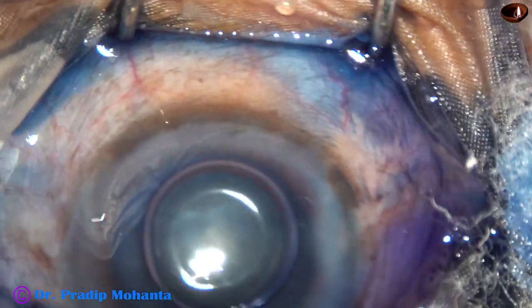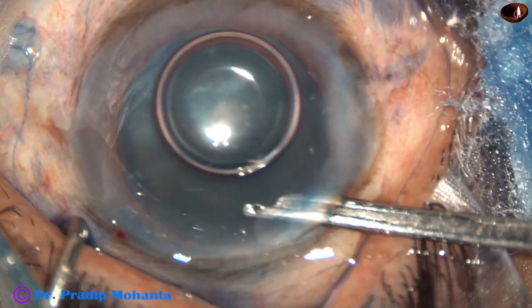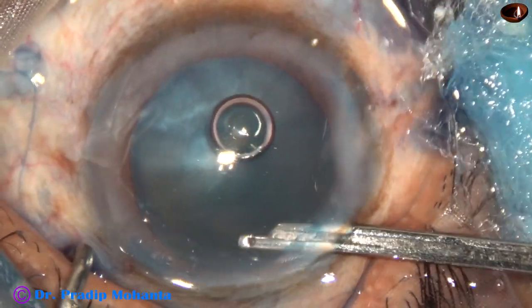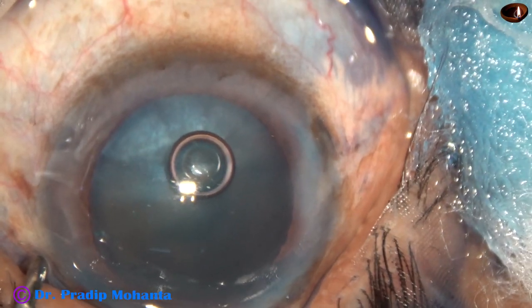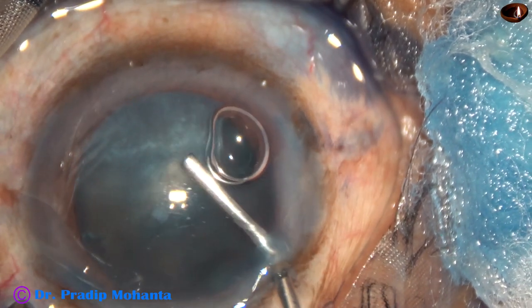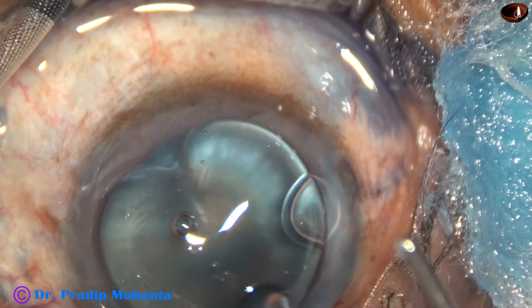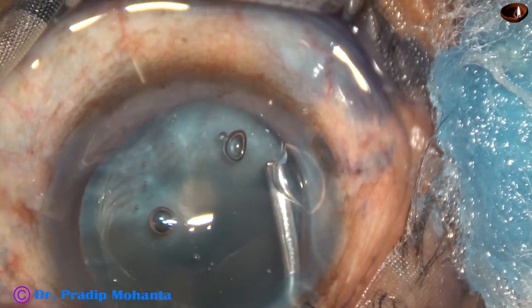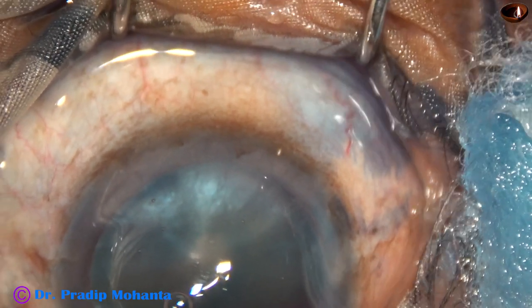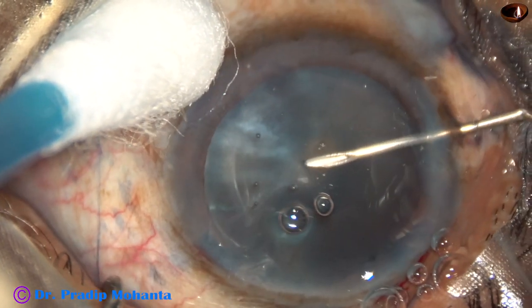Now see, the cataract is not dense white. It appears like an immature senile cataract, but as soon as we incise the anterior capsule with a 26-gauge bent needle, we will see that there is leakage of some oily fluid, which indicates that this is an intumescent cataract with high intralenticular pressure. It is not common to see a cataract like this present as intumescent.